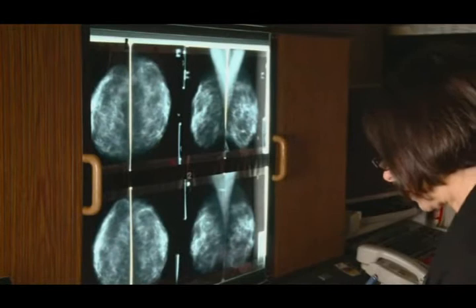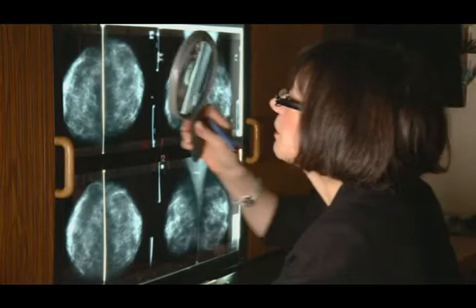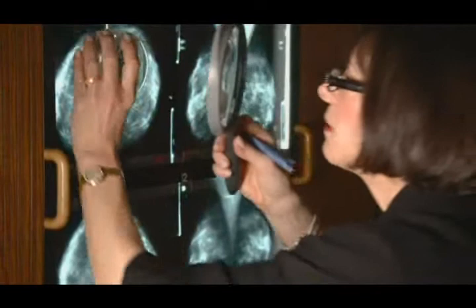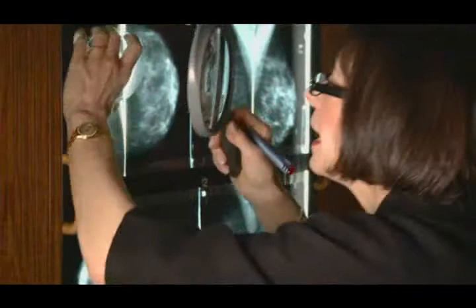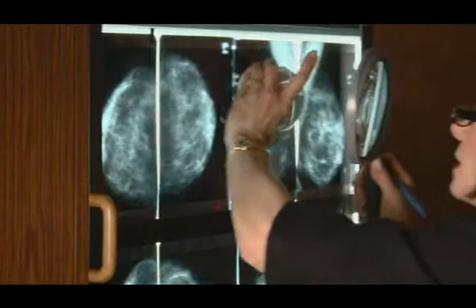I'm going to mark that on the diagram and say it's calcification. I'm supposed to mark whether it's low, medium, or high suspicion. This is an extra way of magnifying it — when we go digital, I won't need this; I can just zoom in and, because it'll be such a high-resolution image, I'll keep the detail while zooming. And these are moderately suspicious — they might even be cancer. So I'm going to write moderate and say she needs additional mammographic views.